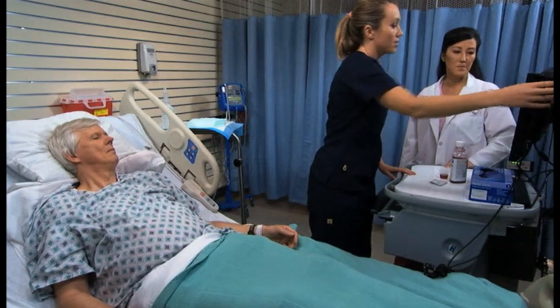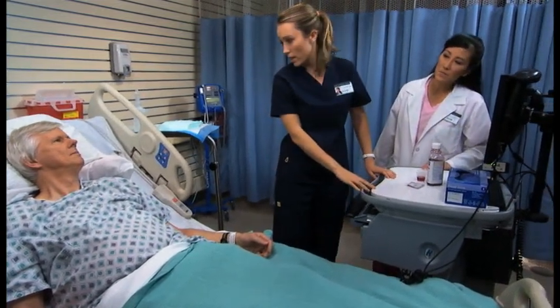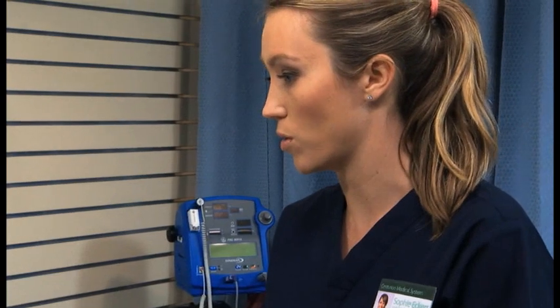Okay, I don't see any allergies in your chart. So, do you have any allergies? No, not that I know of. Good, thank you. Since it's hard for you to swallow, we're going to give you the medications through your tube. That way you won't have to swallow them.